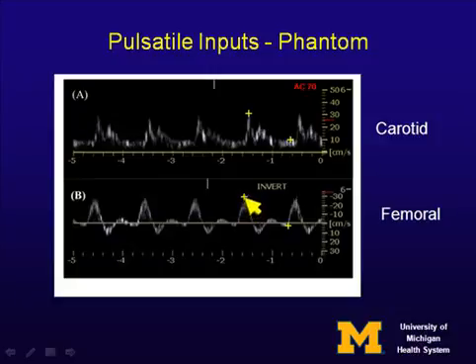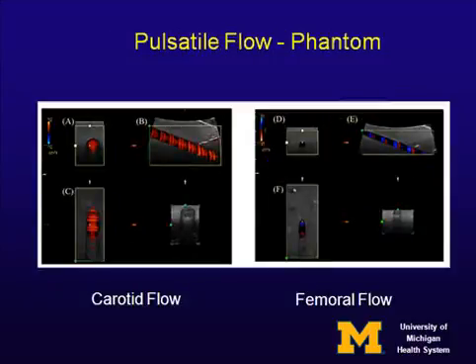And you'll notice that there's forward flow and reverse flow. It's triphasic, just like a typical femoral arterial flow. That doesn't matter at all with this technique. What you see here is something I'm sure you're not used to seeing. This is the original image, which is a transverse.